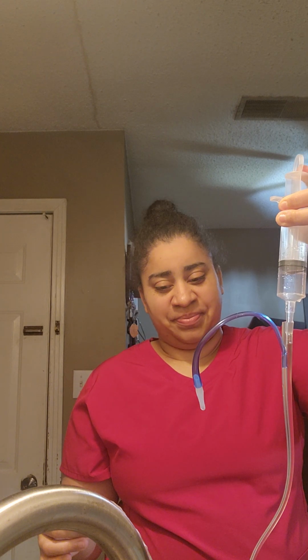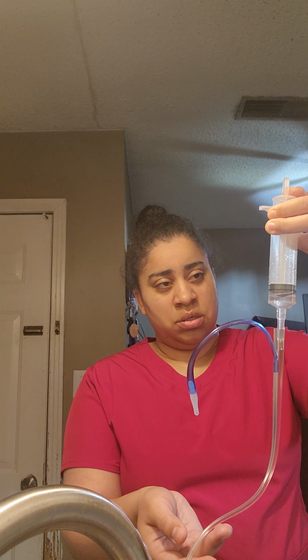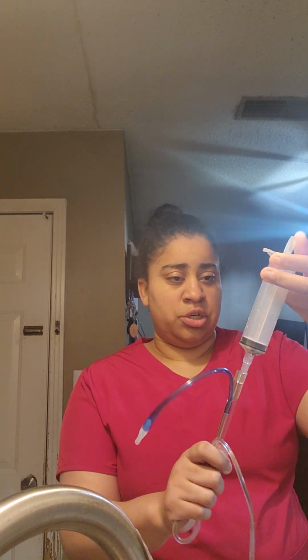And this is my suction, and this is my tube. I'm going to go ahead and begin flushing it slowly. Alright, once I do that, alright, so that is secure.